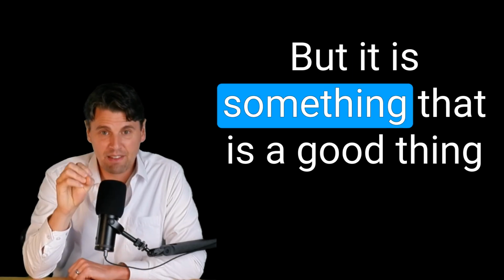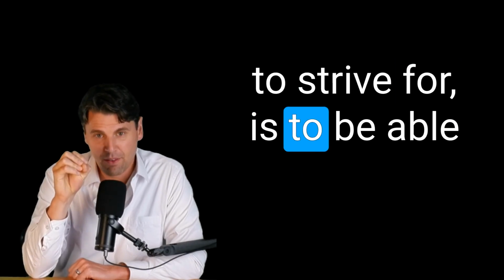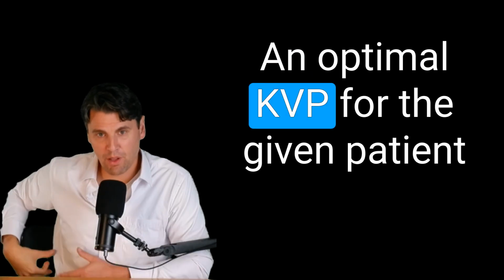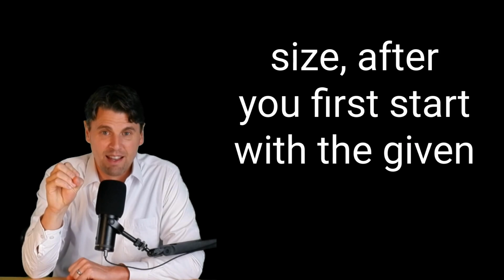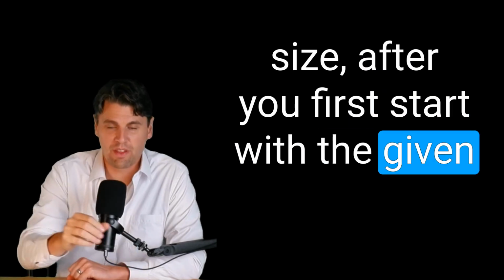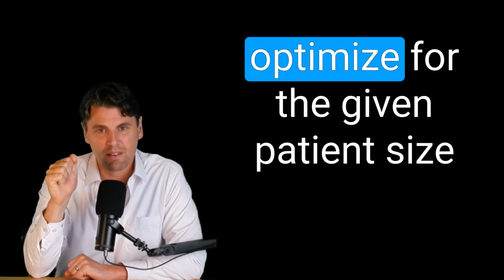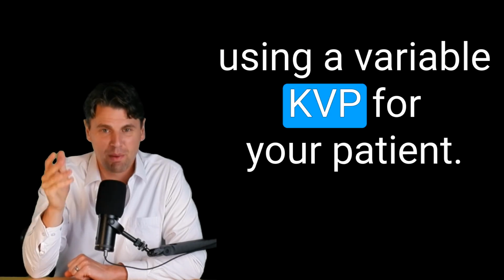But it is something that is a good thing to strive for, to be able to prescribe an optimal KVP for the given patient size after you first start with the given anatomical region. Then you can optimize for the given patient size using a variable KVP for your patient.